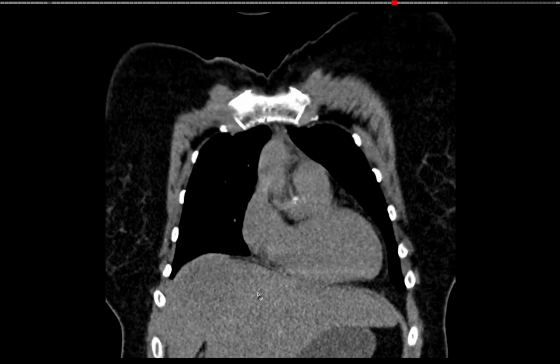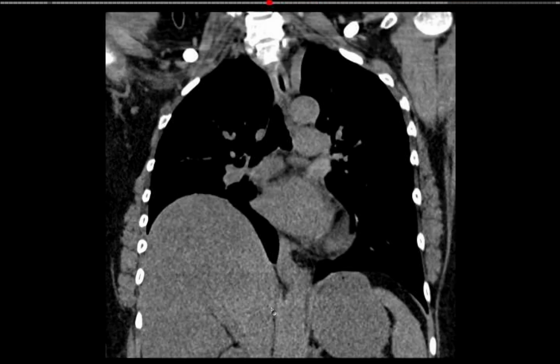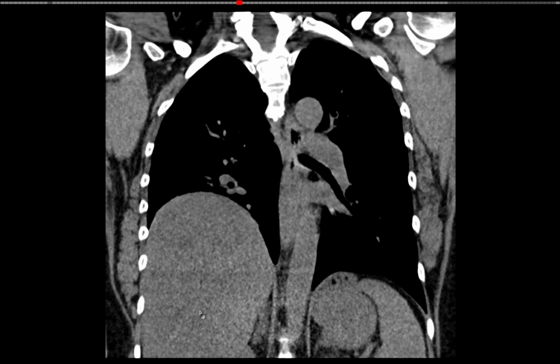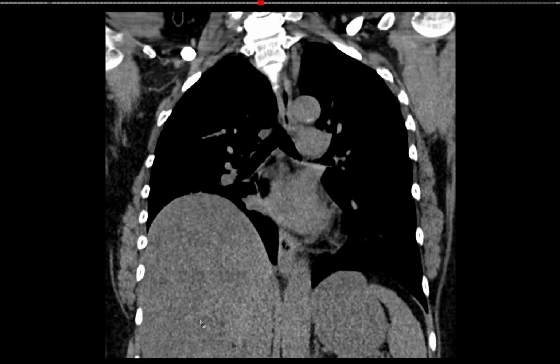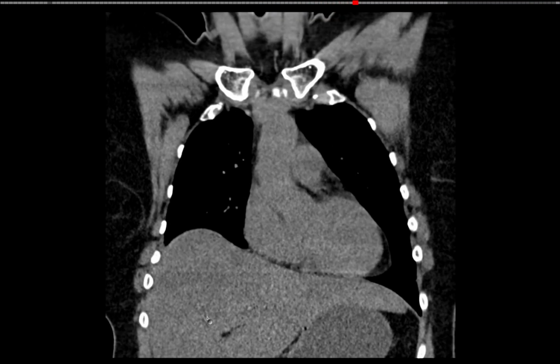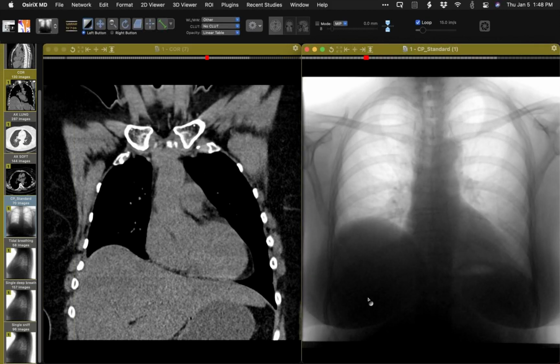So if that band is intact because you've got good muscle tone in it, it's going to pull the diaphragm down when you get near the inferior vena cava. So the shape of the elevation of the right hemidiaphragm, just on a frontal chest radiograph, often tells you that it's eventration and not paralysis, because you have this return to normal height by the time you get near the inferior vena cava, because that posterior muscle is intact. With paralysis, it's flaccid and it's not doing anything. It's not pulling the diaphragm down to normal height there.